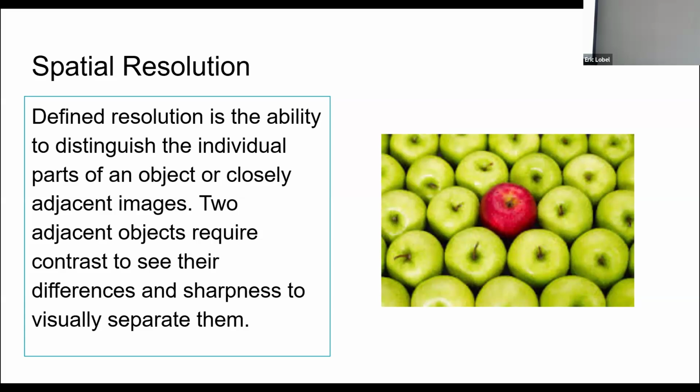Say that again. I have a mouthful, right? So contrast resolution is the ability to distinguish one tissue from another, especially if they're close together, close proximity, because they show up as a different grayscale, right? Different color, different shade. But that different shade is based on slightly different attenuation of the beam. In other words, it absorbs more or less radiation than the surrounding area. So you get a different grayscale.